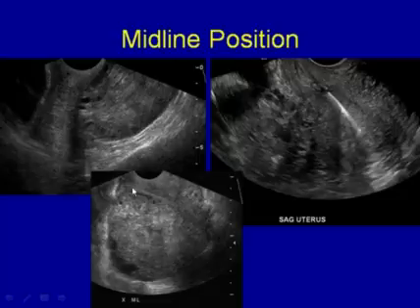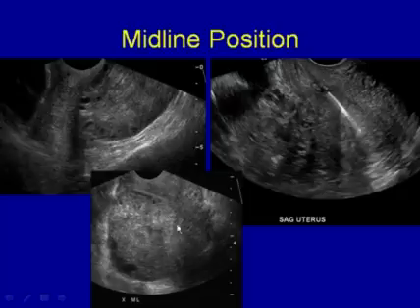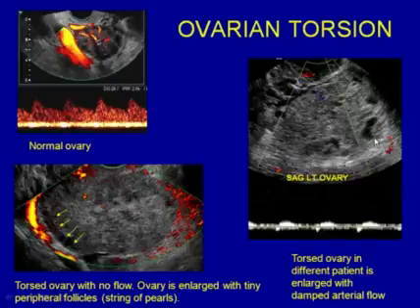Here's another one from transverse imaging. Again, uterus here and large midline ovary, abnormal in appearance, large size, and abnormal location. Again, here's another patient. We can see from the posterior aspect here, the uterus. Here's an IUD in place. Here is the ovary, again, up in the midline and up anterior and above the uterus. So the grayscale picture is classic here.